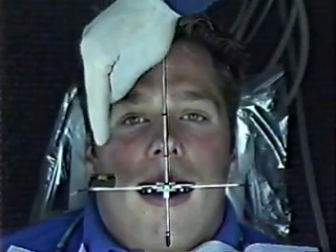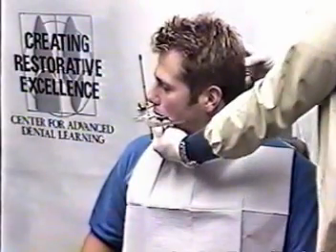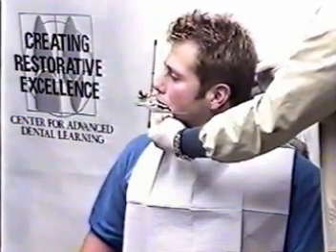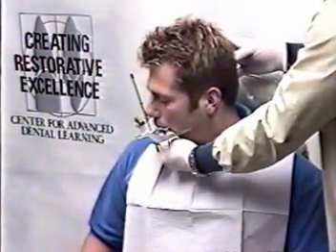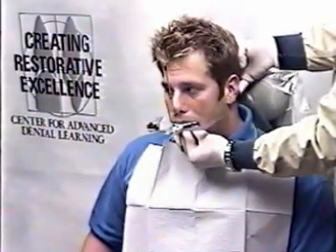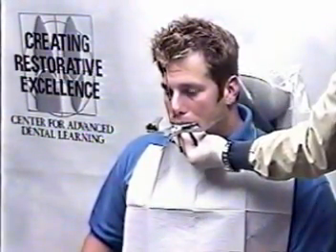Notice also the bubble is perfectly positioned in the center. From the frontal plane, the patient's position in the chair is not as critical. However, from the sagittal plane, it's important that the patient is sitting as erect as possible. Arbitrarily tipping the head too far back or forward would create an error in the positioning of the bow. Doing it this way ensures the occlusal plane is transferred to the articulator more accurately, the way it looks in the patient's face.